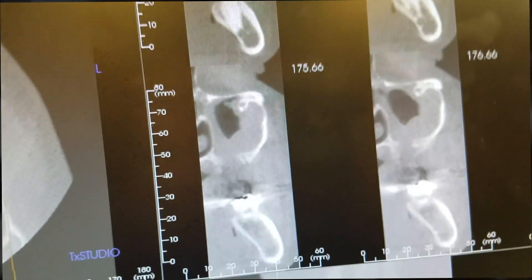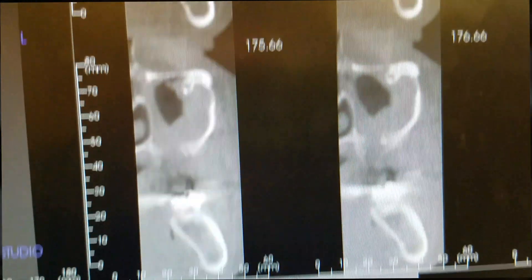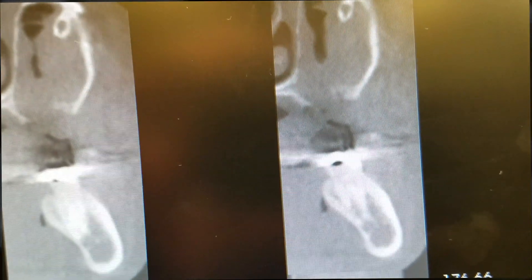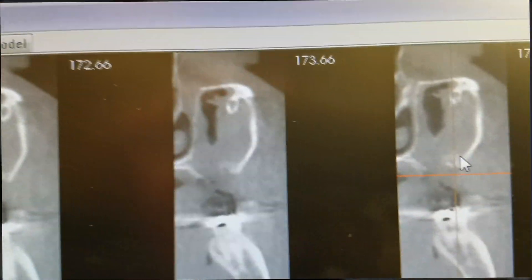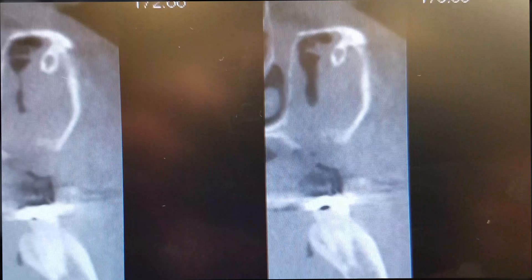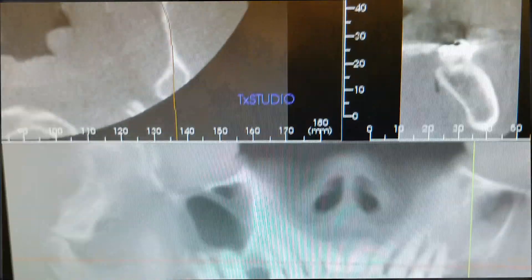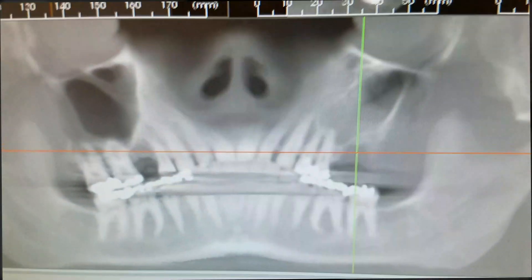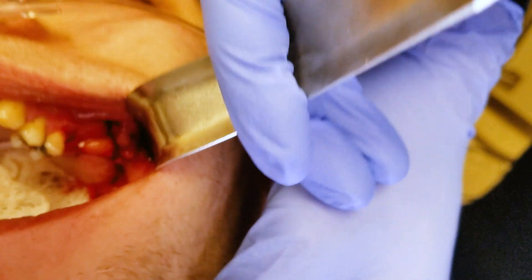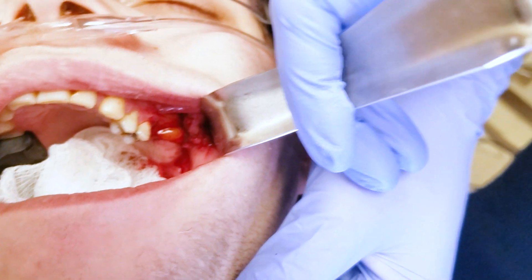Then we'll use some of the buccal fat pad to pull over top of this fistula, kind of right in this area. We'll pull it over, stitch it closed, and then still do a buccal sliding flap to close us in layers.